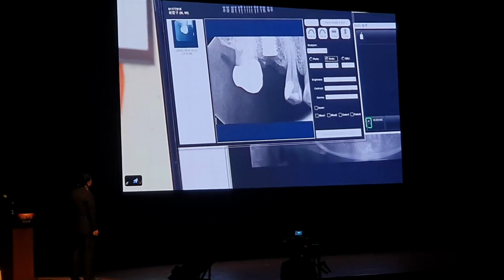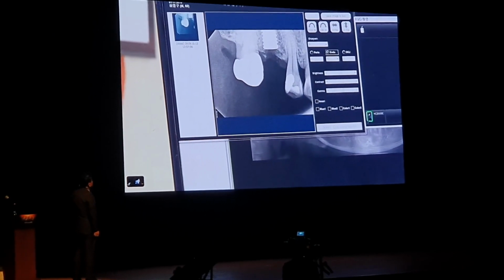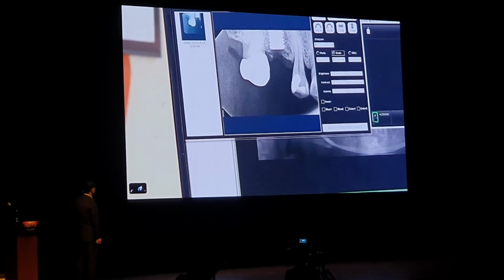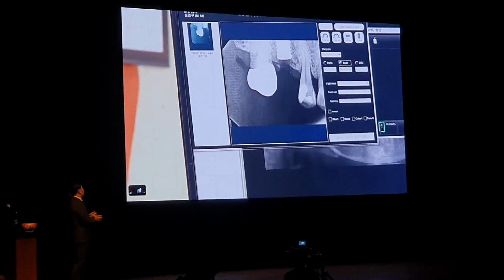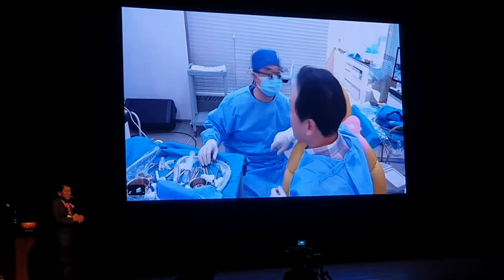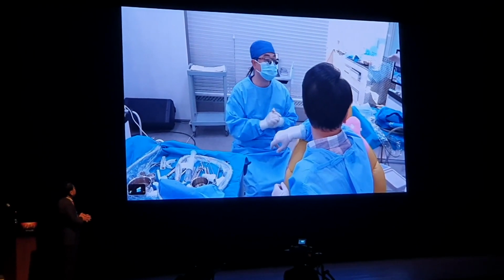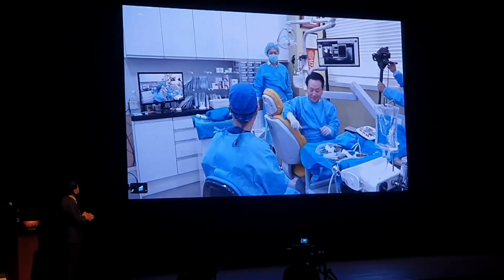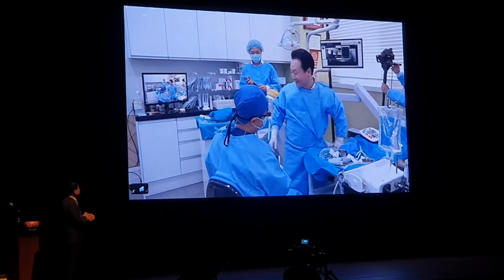So Dr. Ho will now take a panoramic radiograph while wearing the guide filled with a radio-opaque marker. This way we can check the implant position and how the sinus elevation will look. Again, the VARO guide hole will be filled with the gutta-percha to be visible in the panorama. Is it ready? Once they are ready, we'll take a panoramic radiograph. Go ahead. See you in a bit.